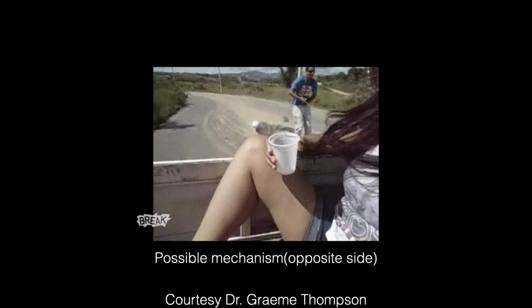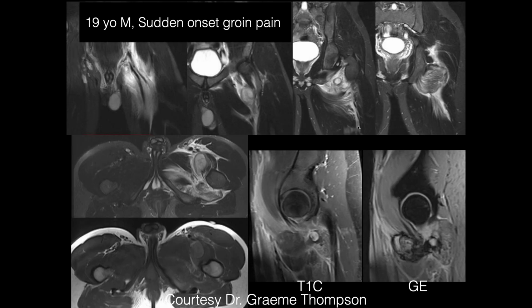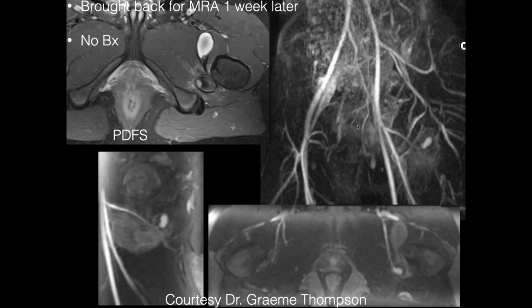So, I guess that who read it initially thought the hemosiderin was calcium? Yes. Okay. Yeah, that's what they're concerned about. And that, I don't think it was worth it. I don't either, John. Okay.